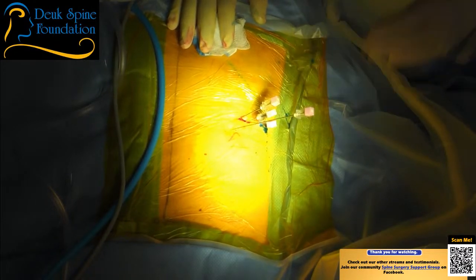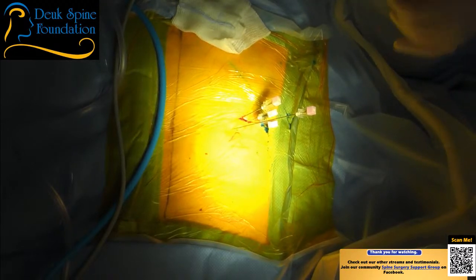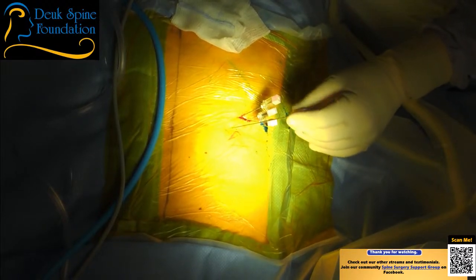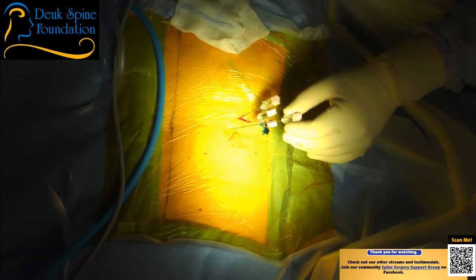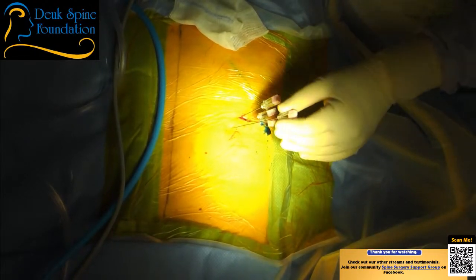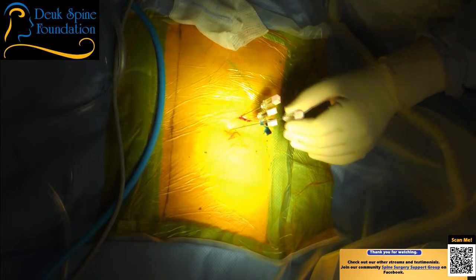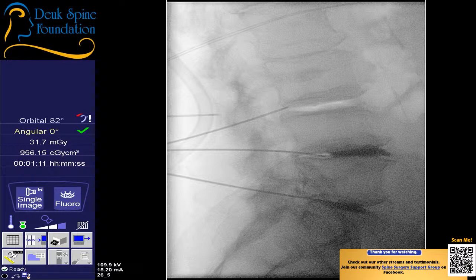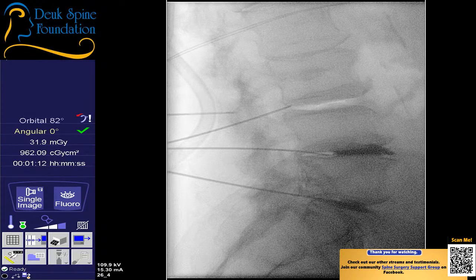A little better than I am now. Shot? Yeah, I think you're fine with the lateral view. Are you comfortable? All right. I'll let you know how everything's going. Well so far, actually better than I expected it to. Shot? Yeah, no, it's fine. Thank you. Shot? That's the facet. That's for sure. So I meant the facet. Shot?